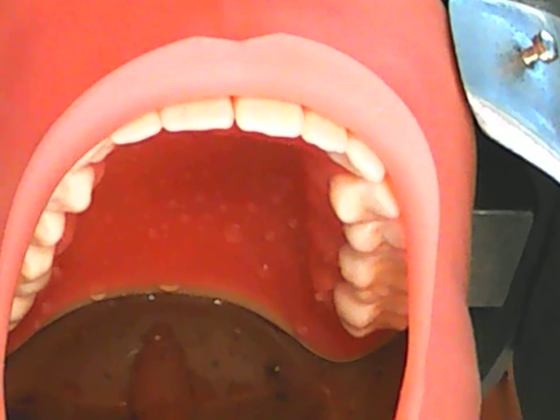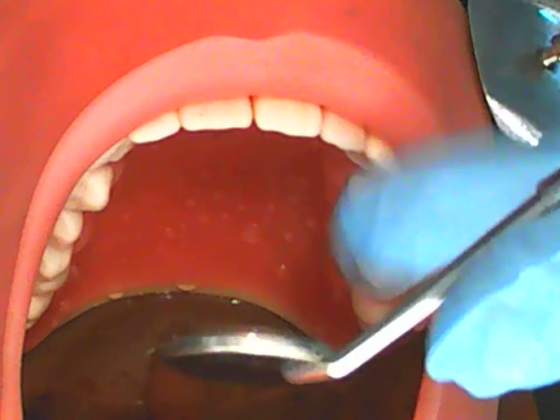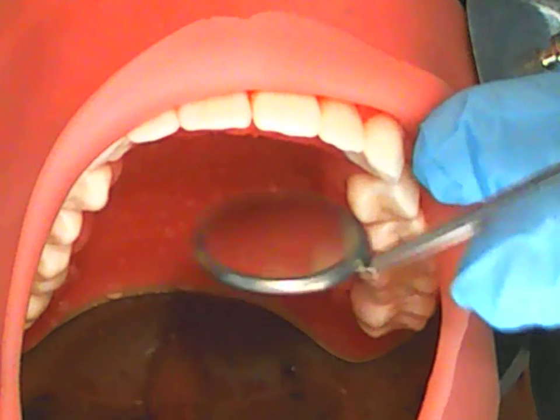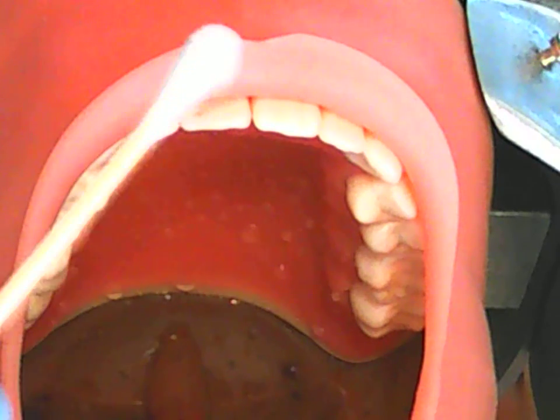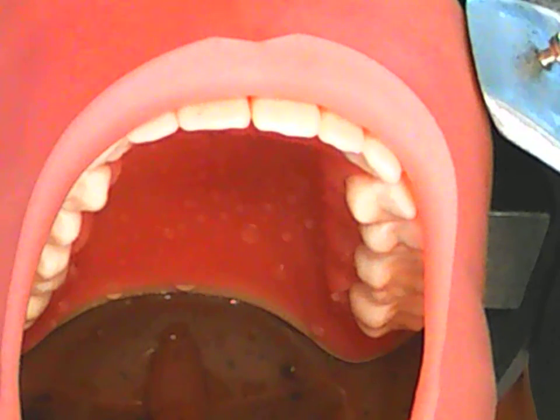When you're ready to begin, sitting in the operator position, examine your treatment area. This will ensure you're familiar with the area for dental dam, and aware of any misaligned teeth, missing teeth, and tight contacts. You may want to place Vaseline on the client's lips at this point if they look dry, or ask the client if that's what they would like. It provides a little extra client comfort.